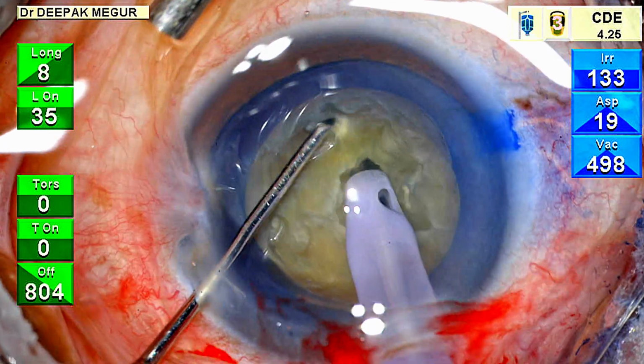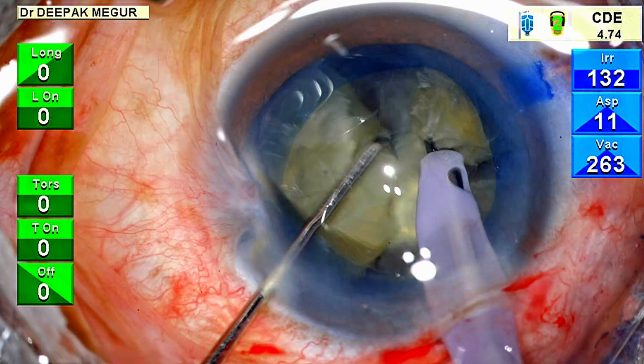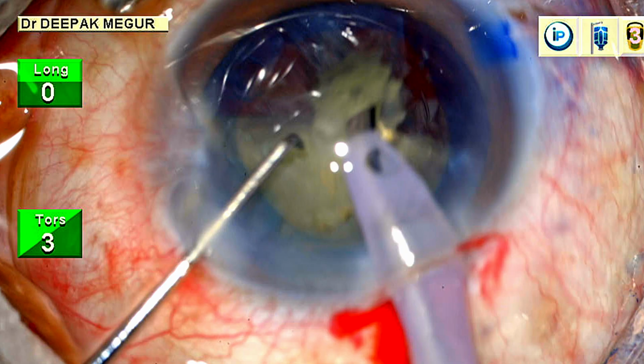So now back to the million-dollar question. When did the PC tear happen? I watched the video at least 6 to 8 times for me to understand when it happened, but unfortunately I just couldn't figure out when. So let me rewind it step by step.